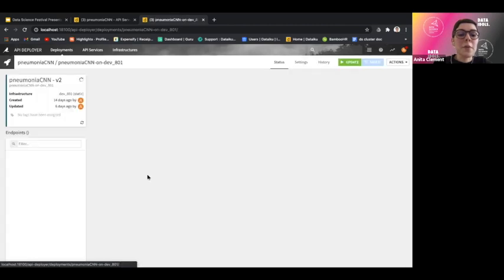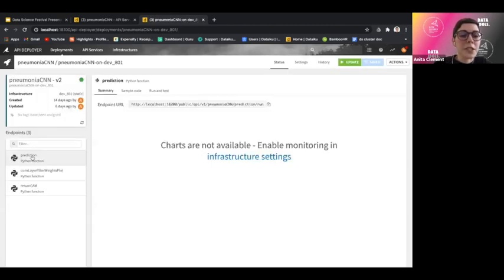So for example, if I open my API service, I have my three endpoints, but the main one is the prediction one. And I have this endpoint URL that people can use for sending an image, so an X-ray image, and get back a prediction, so a probability that the person has pneumonia, for example. But I think there's still an issue in the sense that, okay, now it's more accessible, but you still need some coding skills to understand how to send a request to an API and get back a response. It's not very complicated, but it's still not very user-friendly.